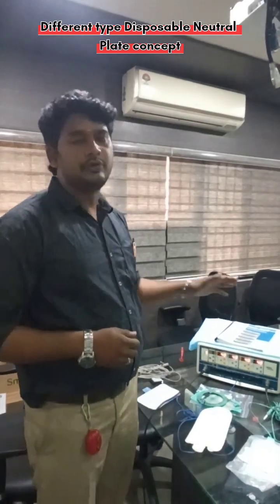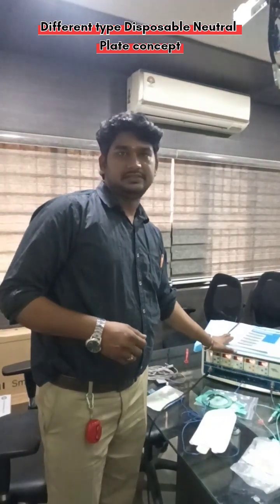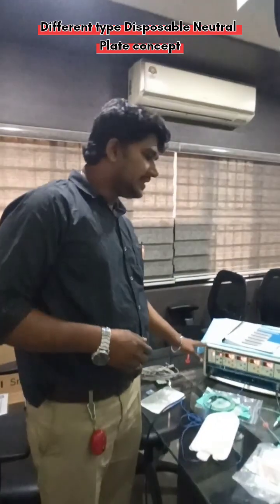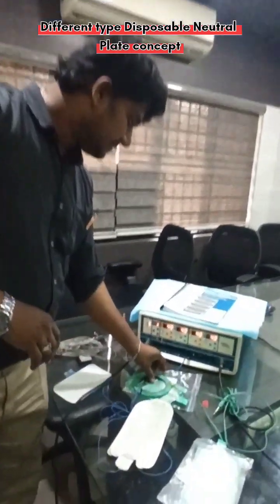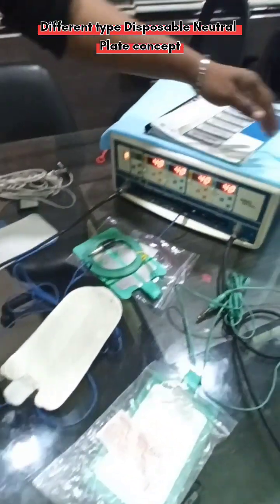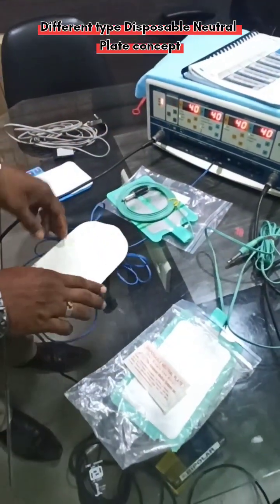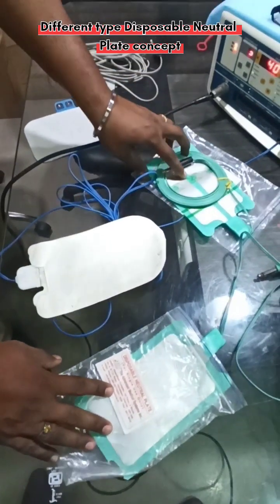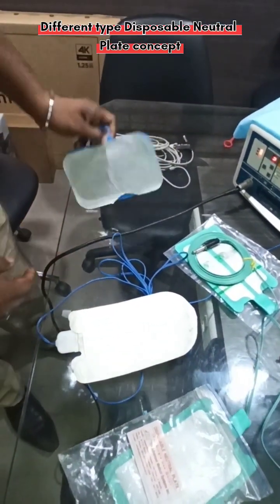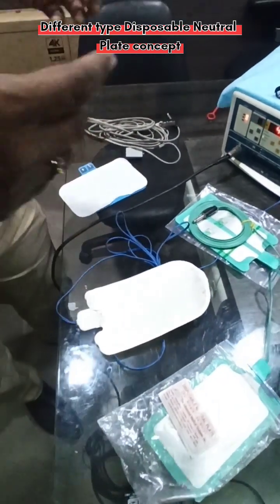I'm going to demonstrate different types of earth plates and their usage in diathermy. Generally, all diathermy machines need an earth plate. This is an electrosurgical unit — we call it a giant diathermy. Here you can see different types of earth plates: this is white color, this is green color, this is green with split type, and this is blue one. There are many types of earth plates, so you may have doubts about which one to choose.